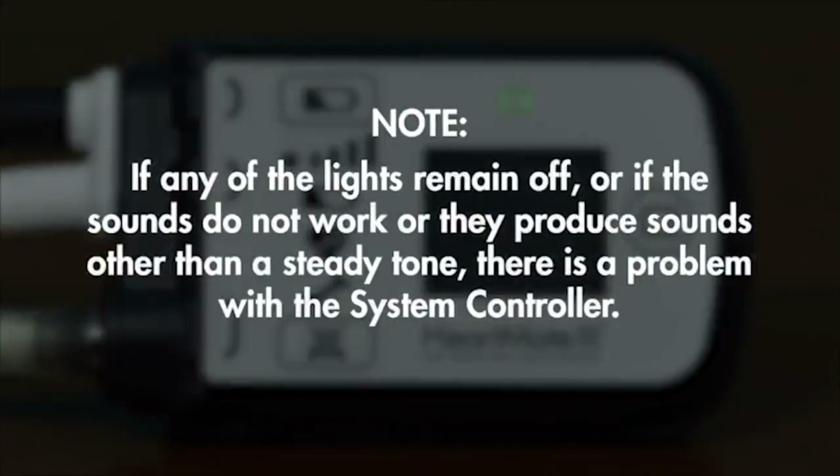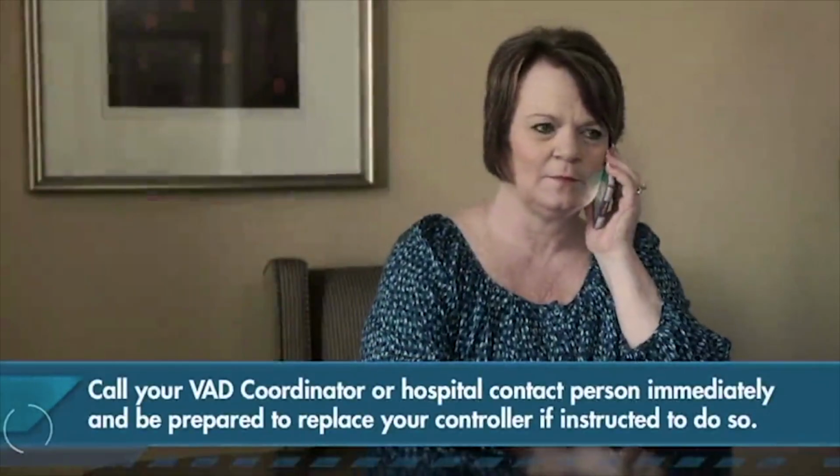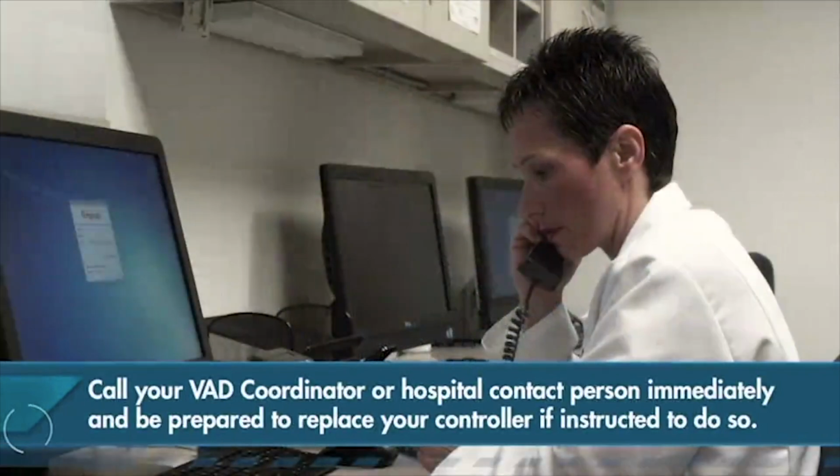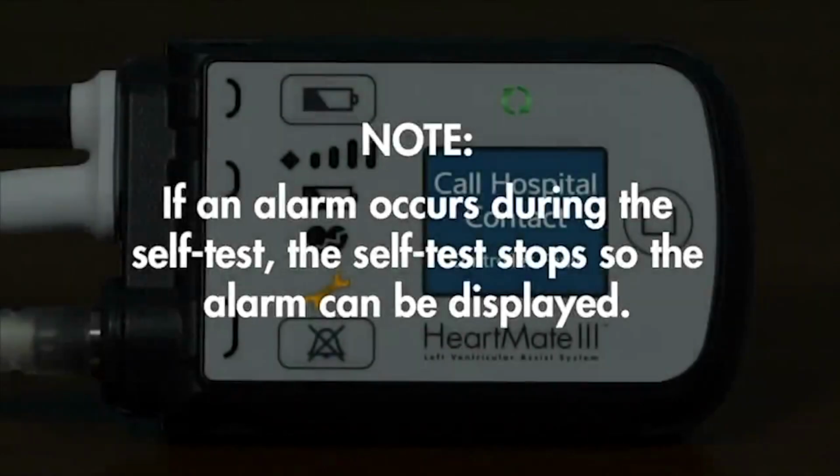If any of the lights remain off, or if the sounds do not work, or they produce sounds other than a steady tone, there is a problem with the system controller. You should call your VAD coordinator or hospital contact person immediately and be prepared to replace your controller if instructed to do so. Please note that if an alarm occurs, the self-test stops so the alarm can be displayed.